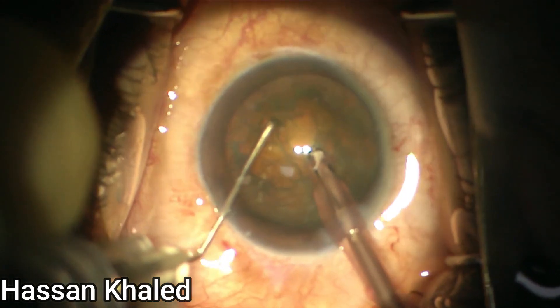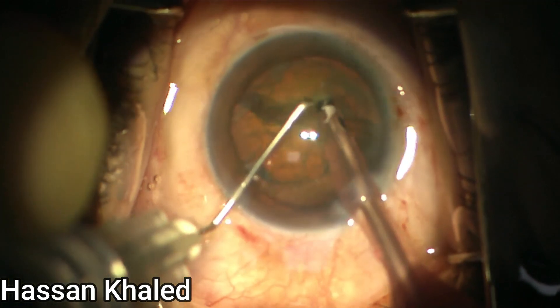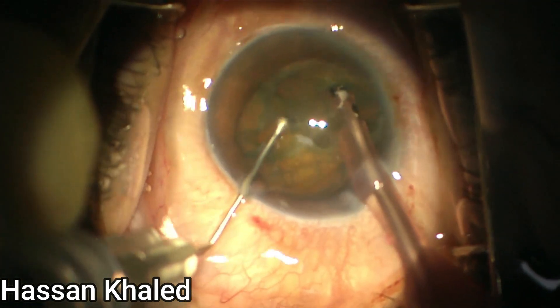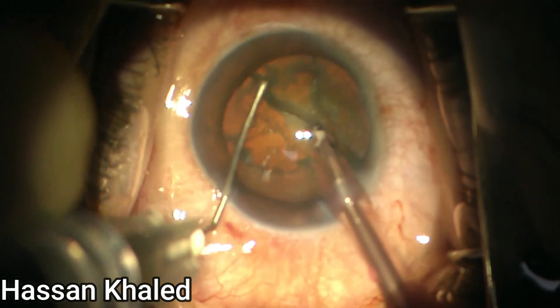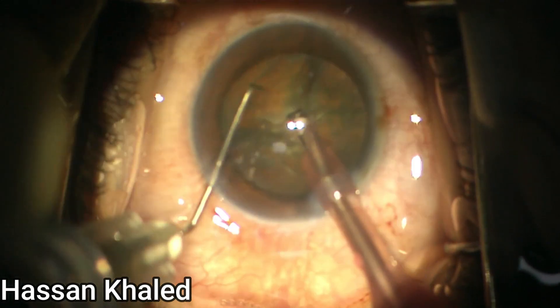Then you can impale your phaco tip into the dense nucleus, and the vertical chopper, the sharp one, is sent right in front of the phaco tip. Then you can see complete separation.